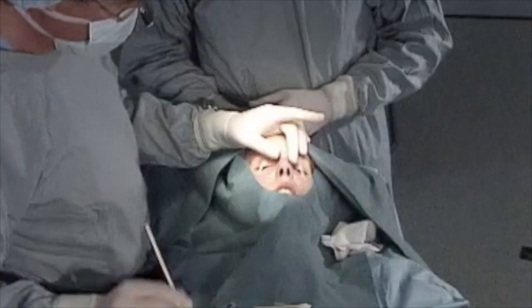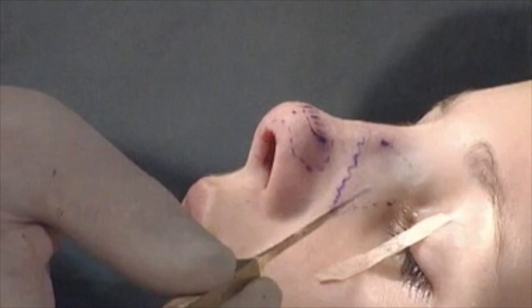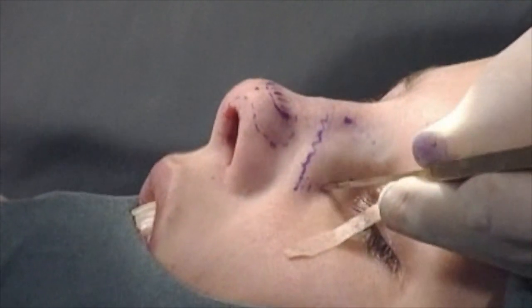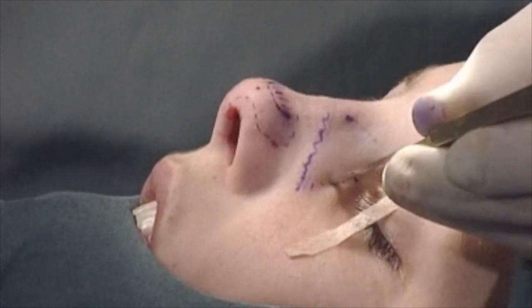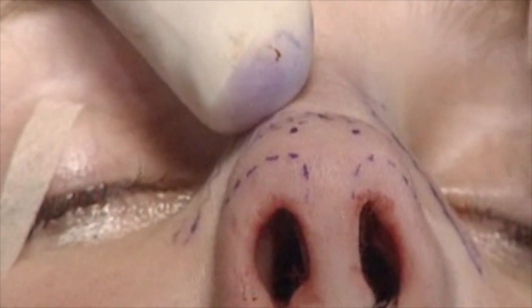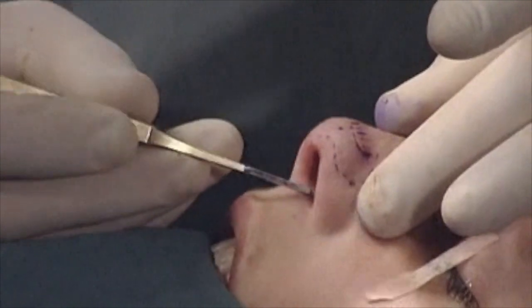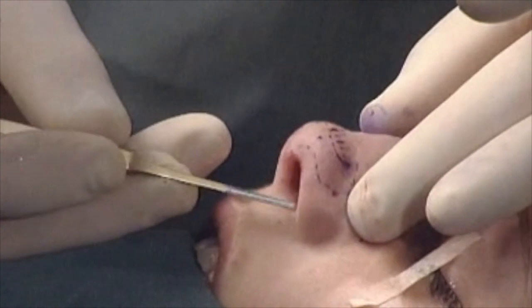Okay. Next step is that we do the lateral osteotomies. We can choose a percutaneous, transcutaneous approach, just through the skin, making little point osteotomies along the marked line of your lateral osteotomy. The other possibility is that you do it endonasally, just bring the osteotome on the piriform aperture at the site of the attachment of the inferior turbinate and go along. It's less traumatic, but less easy to handle.